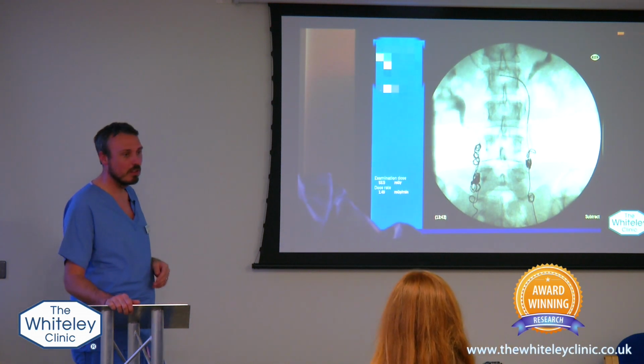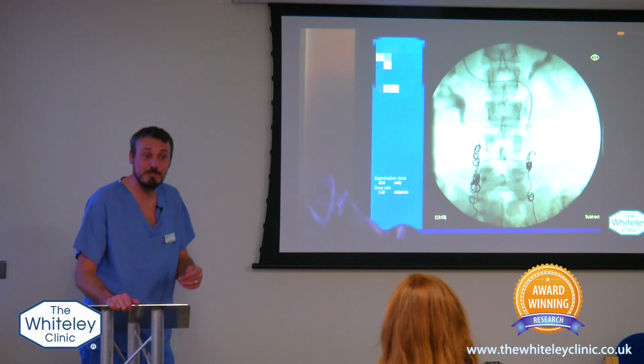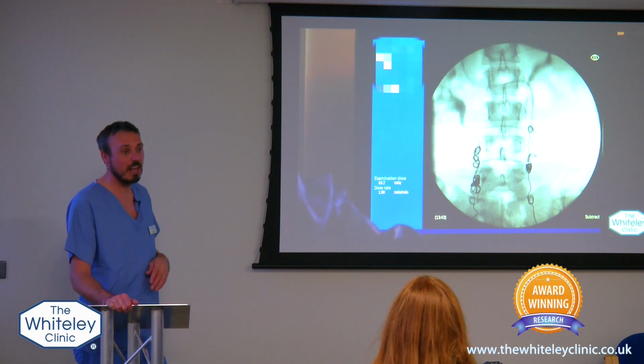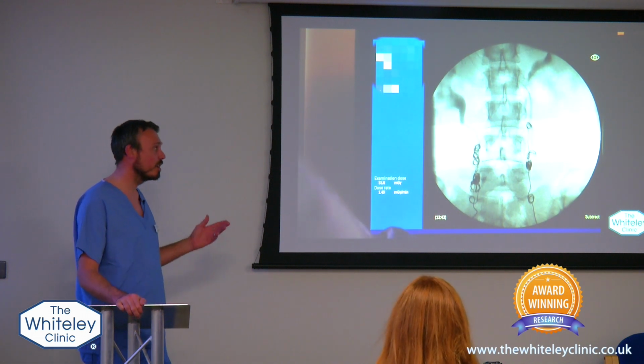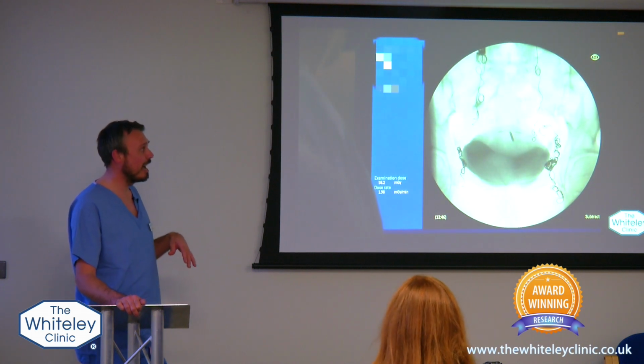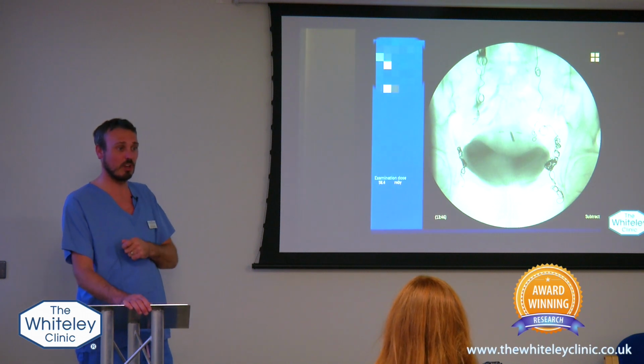Who makes them? Where are they made? They're made by thousands of different companies, and different companies will have different coils. The coils that we choose are by a company called Boston Scientific, and I just like them because if I don't like the position of them, I can just pull the coil out.